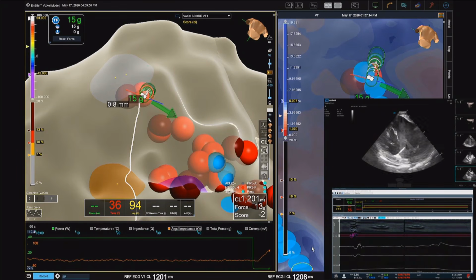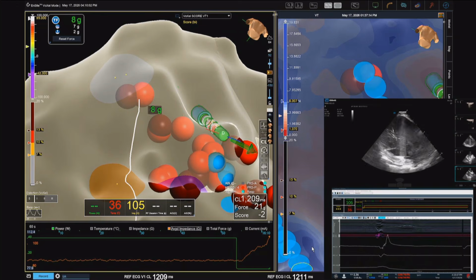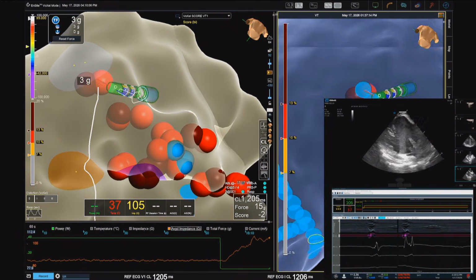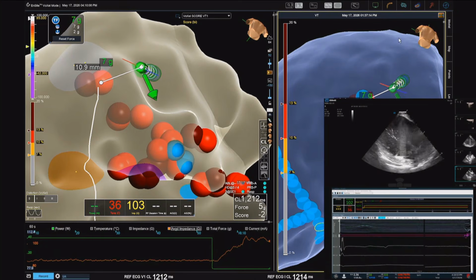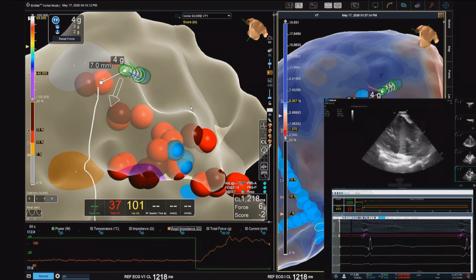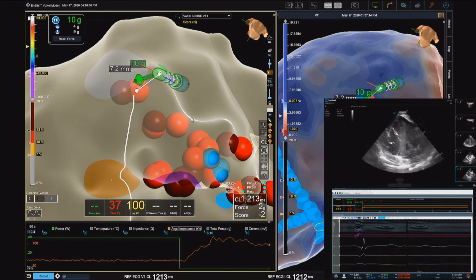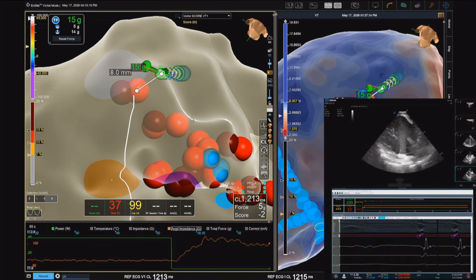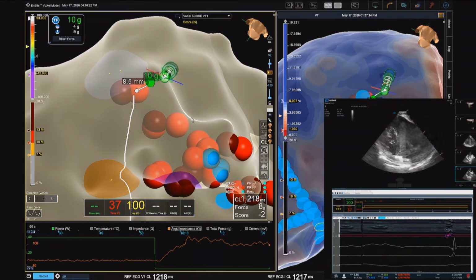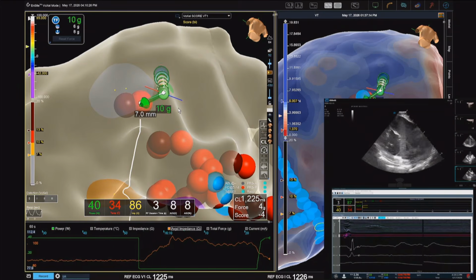We always have more nice late potentials here. I think there is a substantial lesion below your catheter. Yeah, there's a kind of whitening locally under the catheter. I don't know whether this is visible for you, because the transmission of the ice might not be optimal, but generally these are microbubbles in the tissue. I believe they just represent that we heat up the tissue. We haven't seen any steam pops, especially in this scar region.